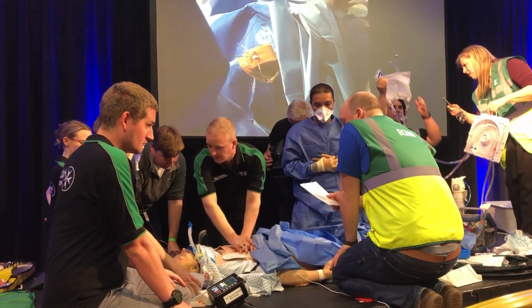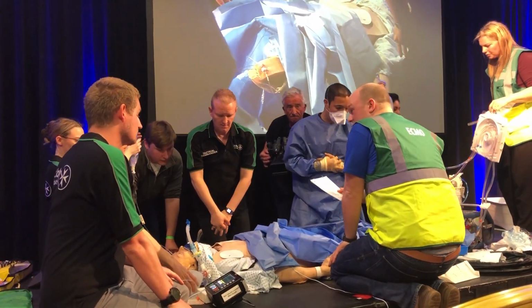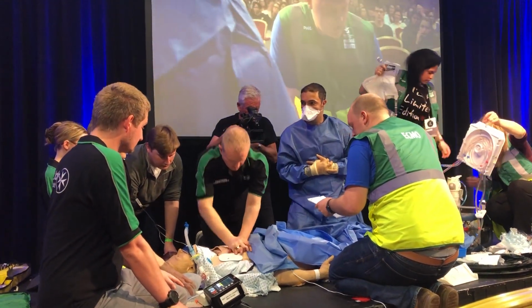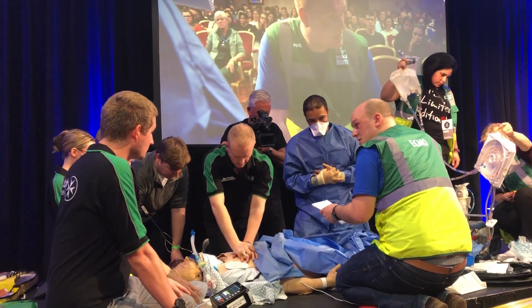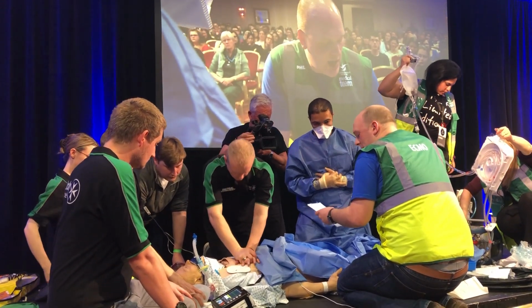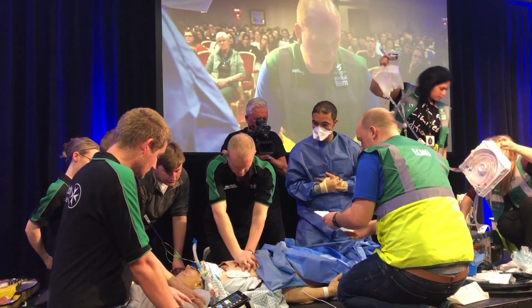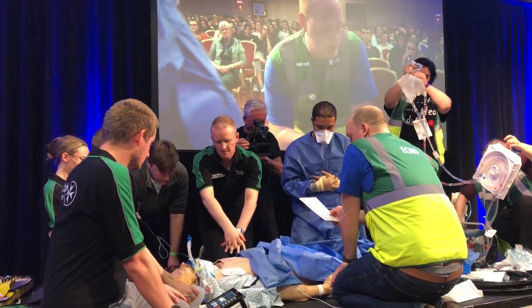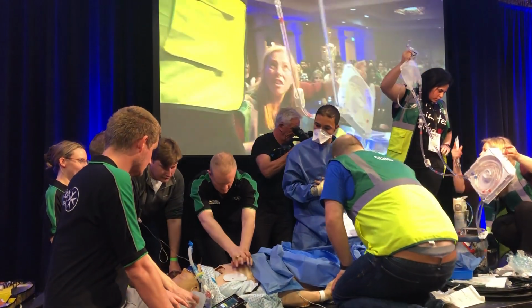Perfect. We're going to run through the ECPR eligibility criteria. 18 to 65 years old. Check. Witnessed collapse. Check. Presumed cardiac etiology. Check. Less than 2 to 3 minutes until chest compressions started. Check. Electrical activity on ECG. Check. End tidal, it's currently 6. Perfect. No severe comorbidities that we're aware of. Check. Not pregnant. Check. And not wearing any study bracelets.